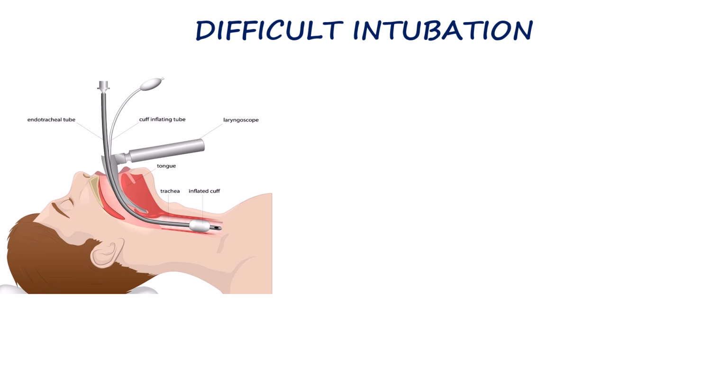Finally, we move to intubation, which is the definitive method for securing and protecting the airway. When intubation cannot be achieved, alternative techniques must be used to maintain oxygenation and ventilation, marking the beginning of difficult airway management.